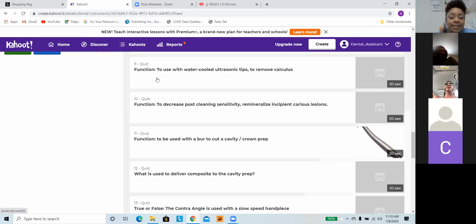Listen to the question. Your hint word is ultrasonic tip. It's on the prophy tray and it squirts water.